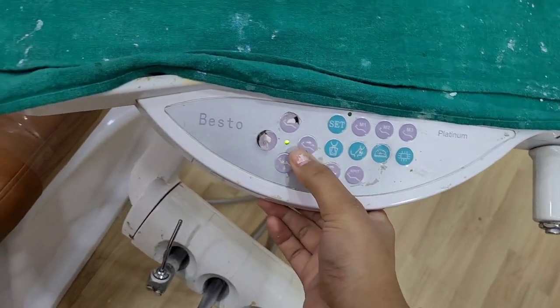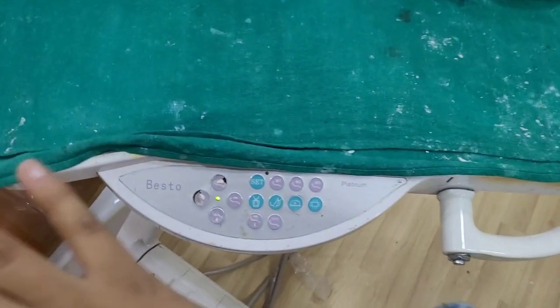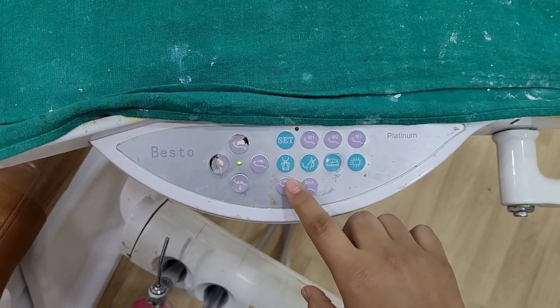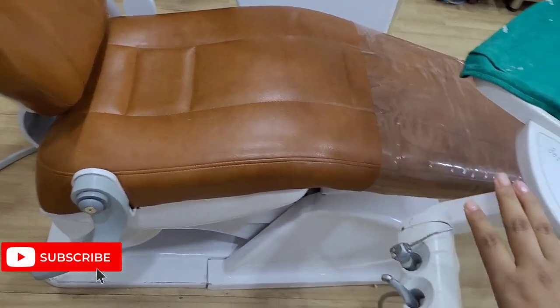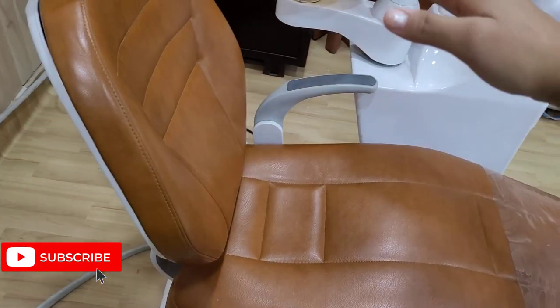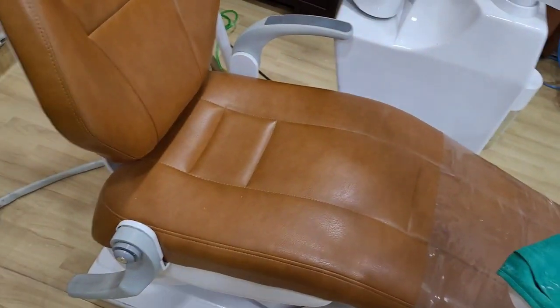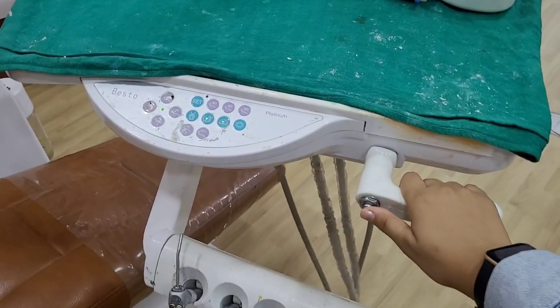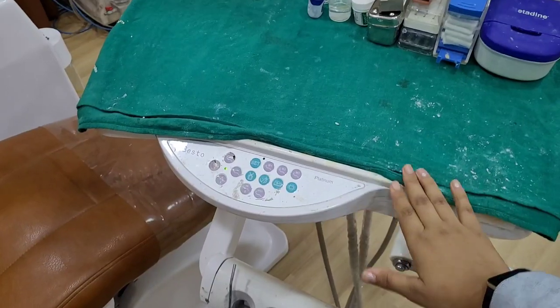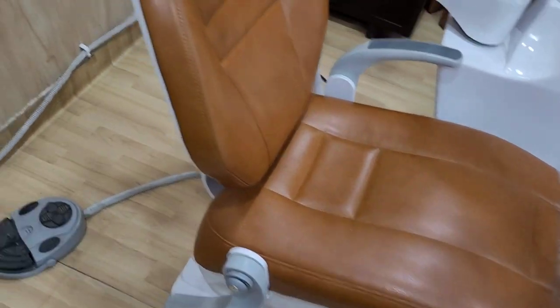Now we will put the seat down to the floor position. Once the treatment procedure is finished, we bring the chair back to the main position. We will put the chair in the upright position first. If the chair is very high, the patient will have trouble getting off. So we press the button and bring the chair down to make it easier for the patient to get up.